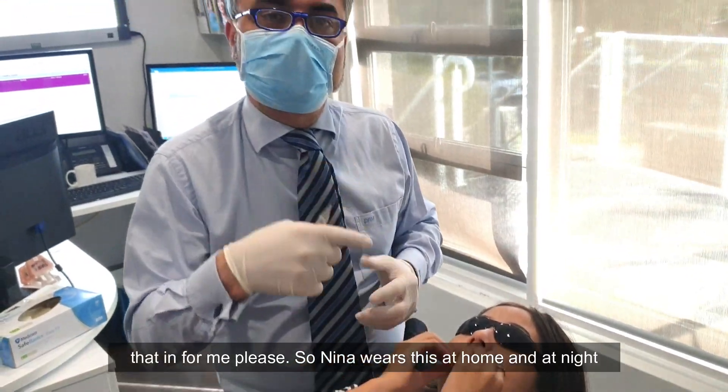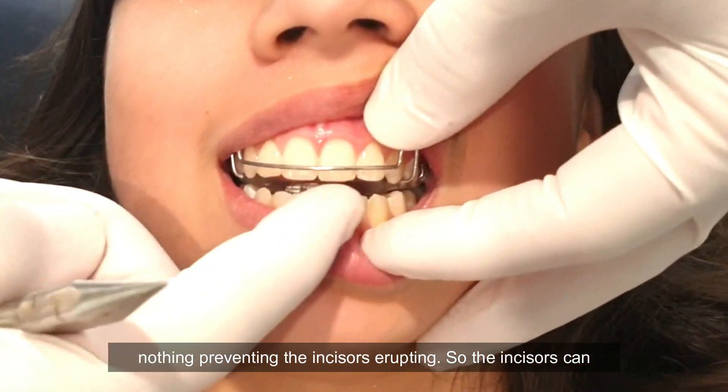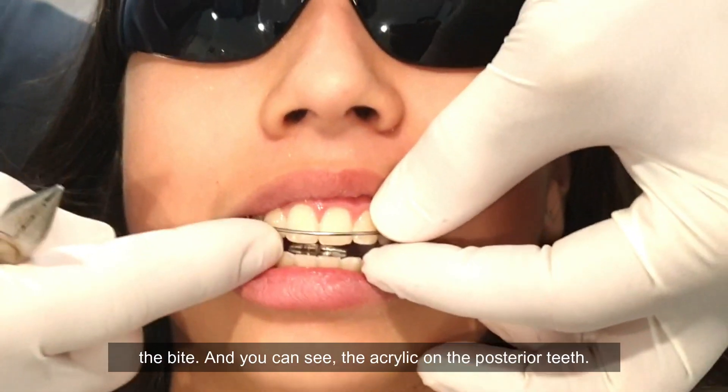Nina wears this at home and at night after phase one. Can you see how there's nothing preventing the incisors from erupting? So the incisors continue to erupt as the mandible is held forward, and that deepens the bite.